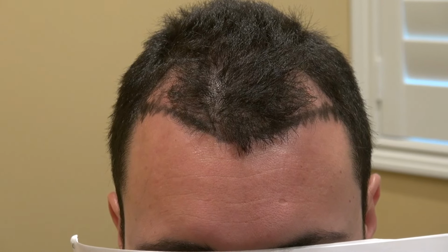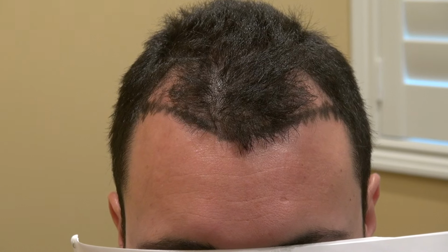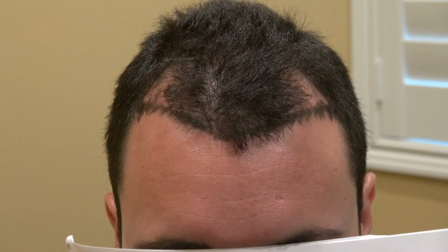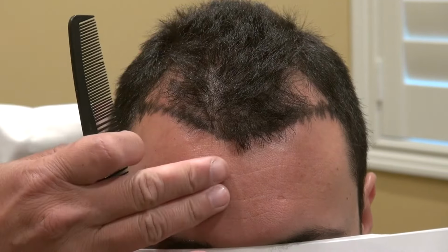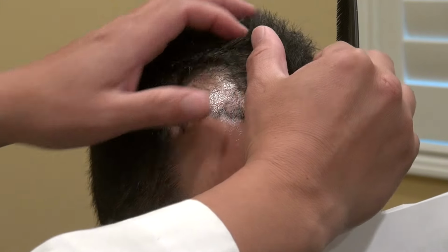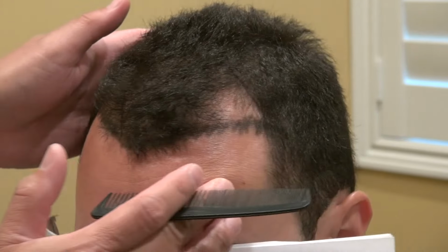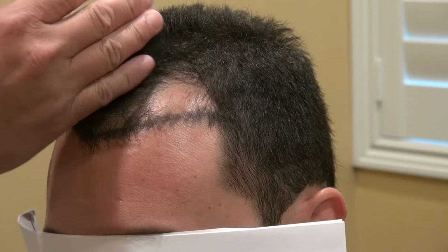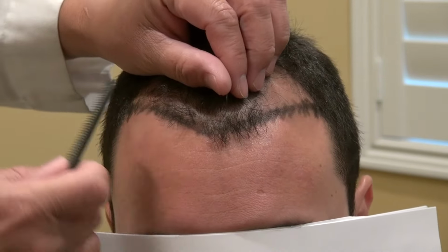Hi, this video is the art of hair transplant restoration surgery on a client who has a receding corner, like an M-shaped pattern hair loss where he comes up, he comes down. If we're going to show the audience this way, and we pull the hair out, this is how thin his hair is, and you turn this way, and see how significantly thin his hair is. But you see how when I draw the hairline, it flows down and it's continuous.